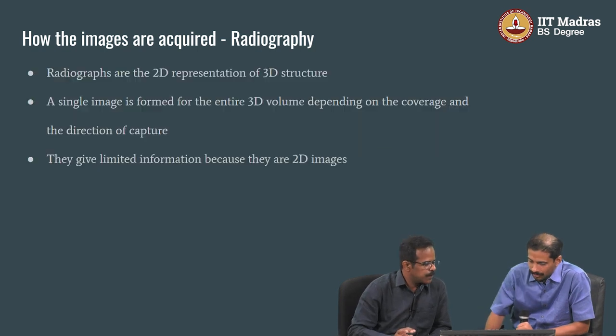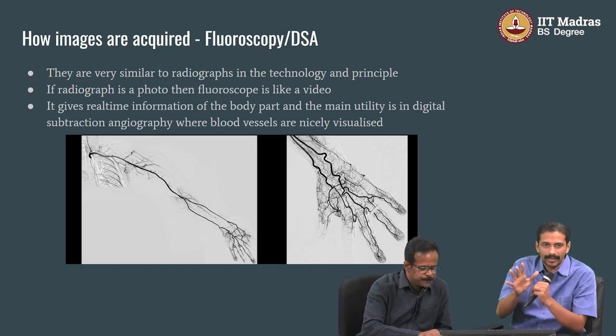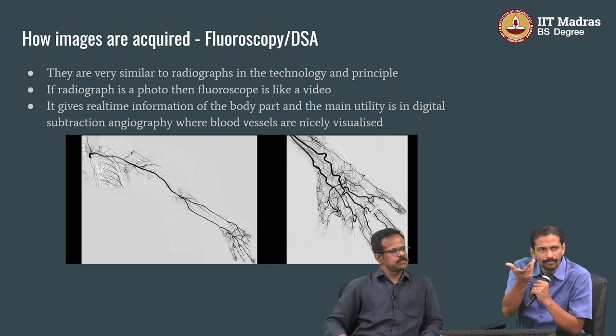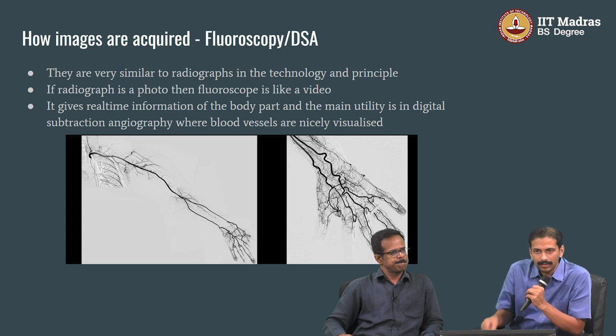All right, so let's keep those text slides. There is nothing in there. So what is the next modality? The next modality is something called fluoroscopy. What is fluoroscopy? Many of you might not have heard of fluoroscopy at all, but there is a modality which exists in the radiology domain, which is called fluoroscopy.